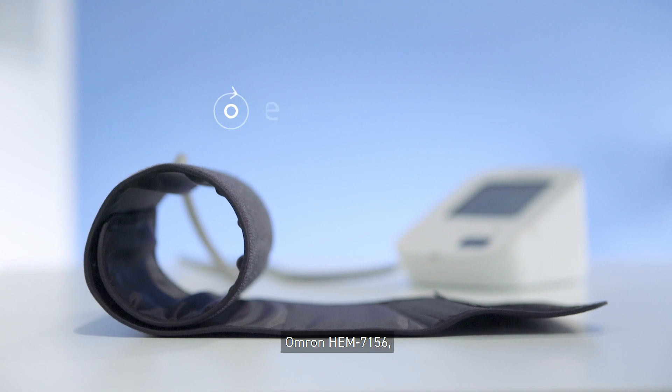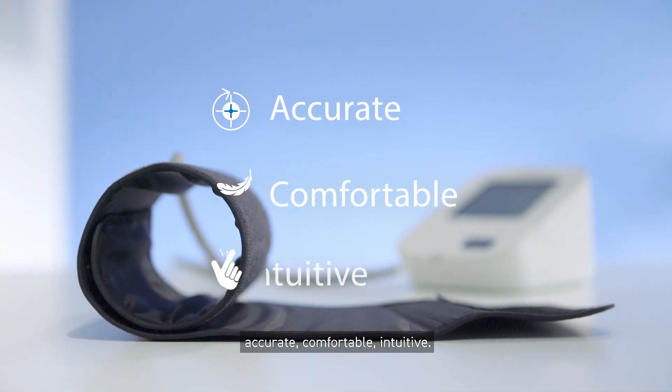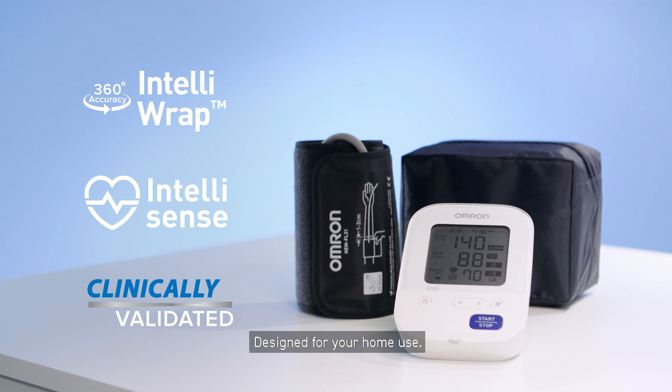Omron HEM 7156. Accurate, comfortable, intuitive. Designed for your home use.